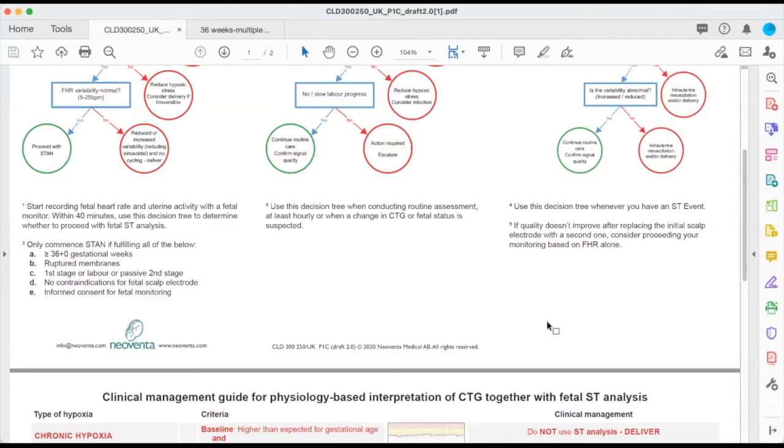Theoretically, what do you think can be different to a smaller baby than a term baby? What would be different? With the fetal ECG? Yes. Why am I not using it on a 34-weeker? What's the problem? Do they use their energy stores differently and so would end up with a different ECG?